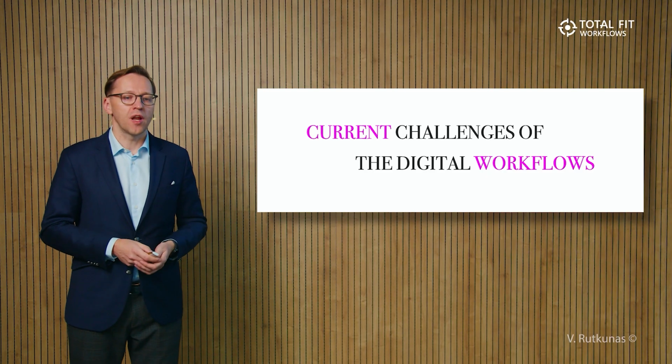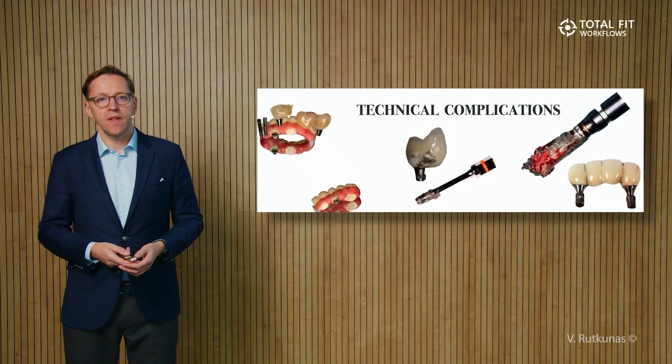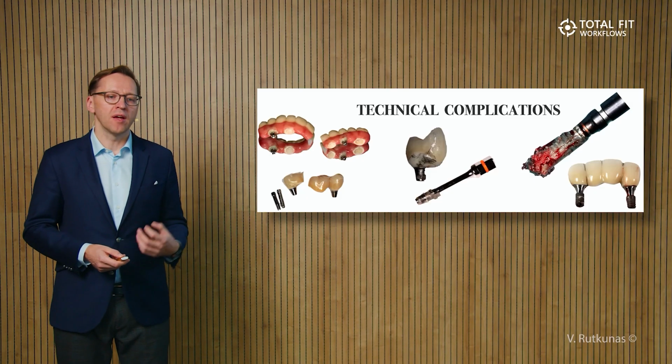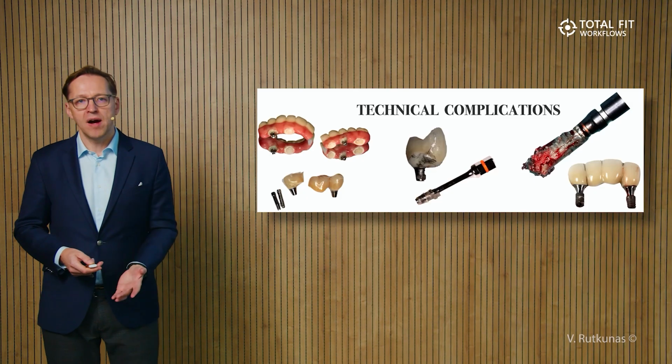What are the current challenges of the digital workflow in our daily practice? Let's review them. First of all, technical complications. I have to tell that the number of technical complications is really decreased, but still we have them, and they're happening at 3 different levels: at the prosthetic level, at the abutment level, and at the implant level.